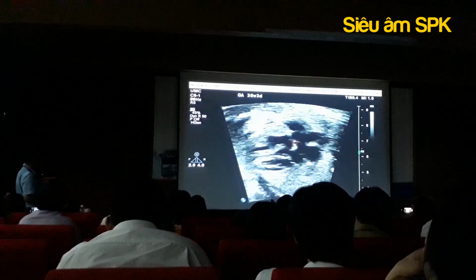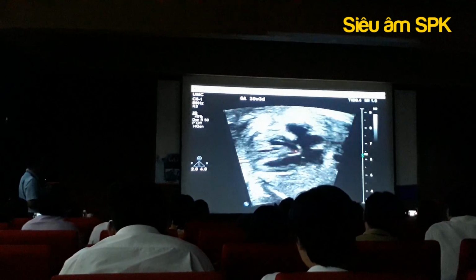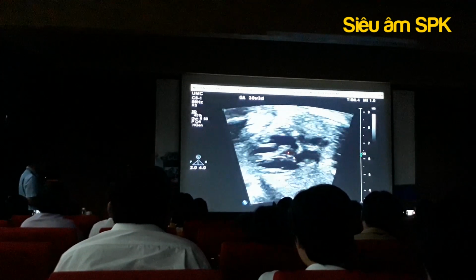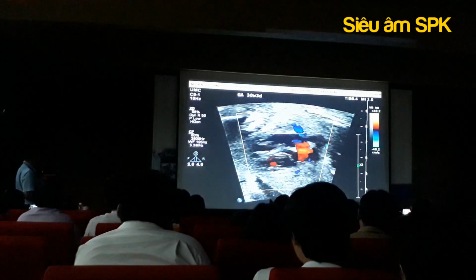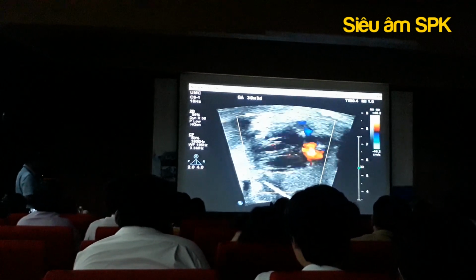It looks like there may be a ventricular septal defect. Có thể có cái lỗ thông thấp ở đâu đây. Here, I want to see that. Maybe with color. Để ý cái màu ở đây.